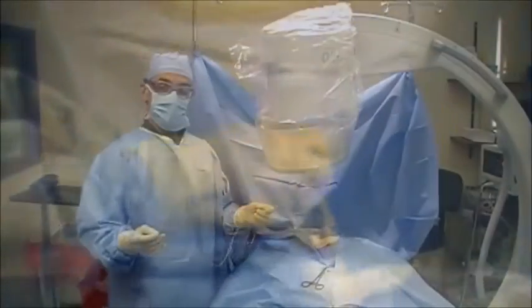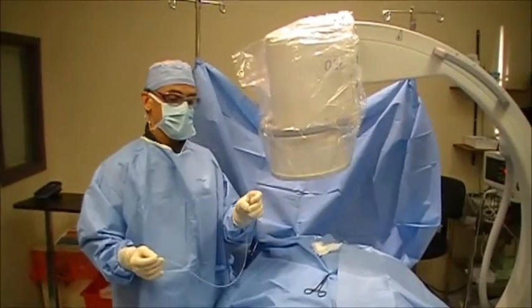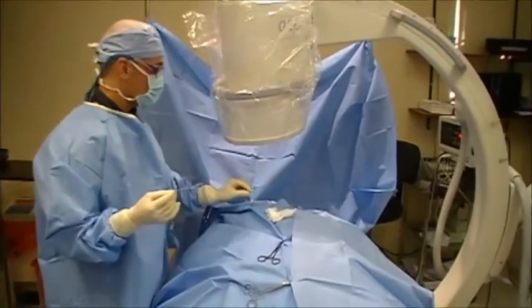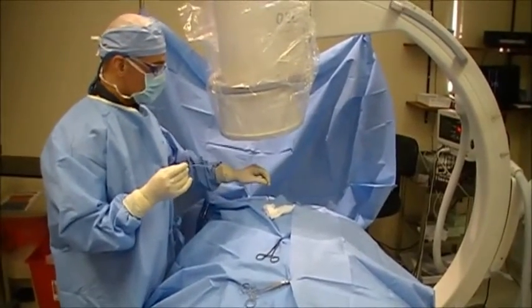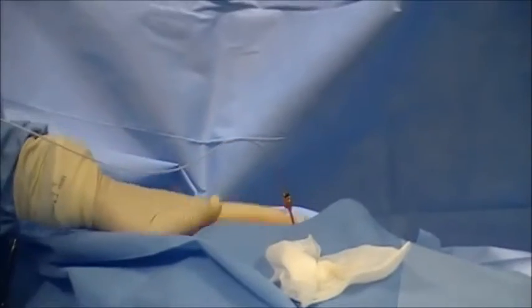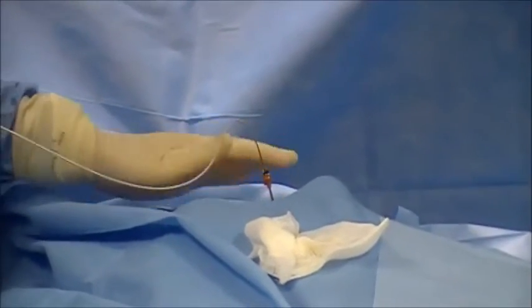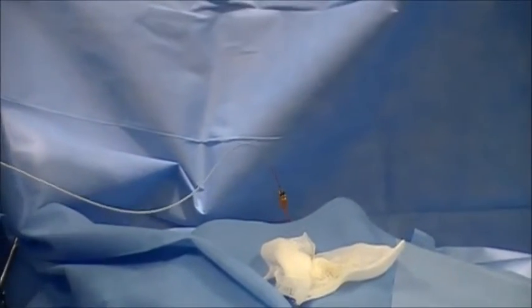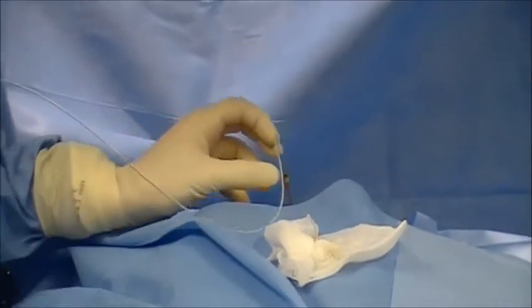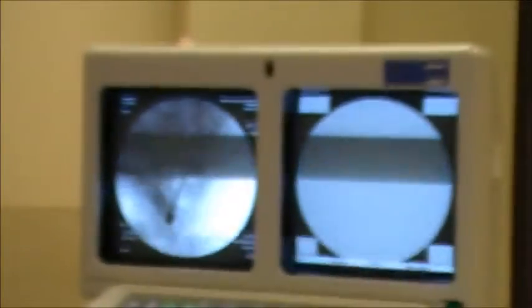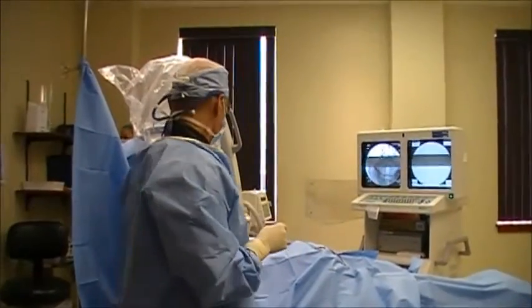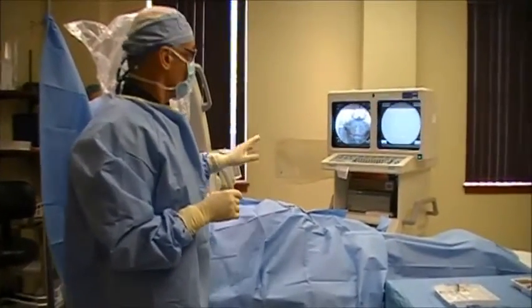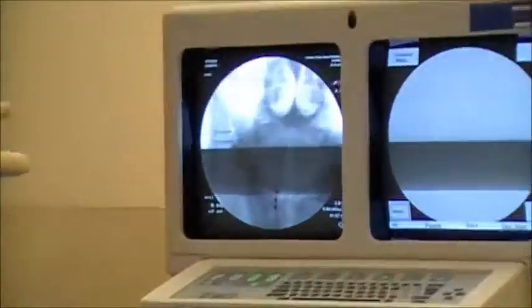Now that I know the needle is correctly placed, I'll gently try to slide this spinal cord stimulator lead rostrally up to the cervical area. Being at T2-3 now — which is almost between the shoulder blades — I'm going to try to advance the lead all the way up to C3, which is almost towards the base of the skull. I'll advance that gently while looking at the X-ray machine. I've now placed this spinal cord stimulator lead rostrally to the C3 segment. On the fluoroscopy you can see the eight contacts, positioned just off to the left side.